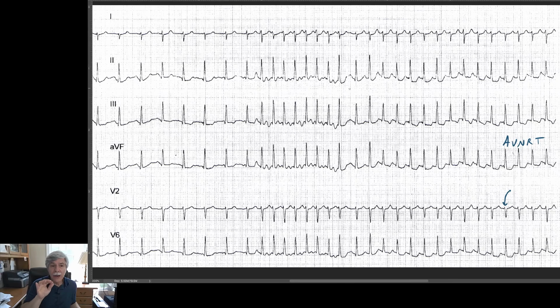It could have been from anywhere in the high right atrium, but that could trigger an atrial tachycardia, and sometimes it could be reentry, or sometimes a rapid beat like this can trigger that calcium-dependent triggered activity, those delayed afterdepolarizations. I see that all the time. And then as the adrenaline comes down and as the problem improves, it slows down gradually and then it'll break. So if I had to guess, I would say this could be a triggered focus in the atrium. The AV node is a bystander.